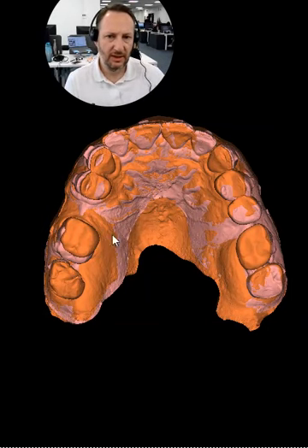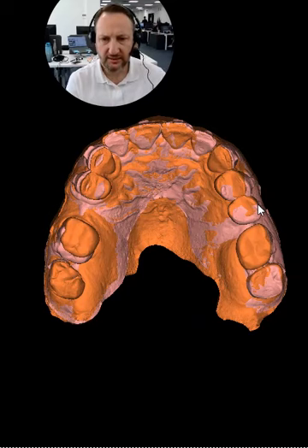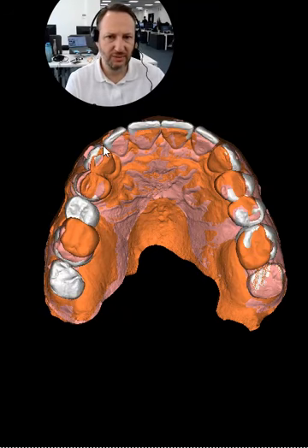This case could be solved with an implant here and maybe restorations, but we saw that the design according to the patient's midline, the face, the esthetic aspects and everything else we take into consideration, wasn't in this position but in the white position.